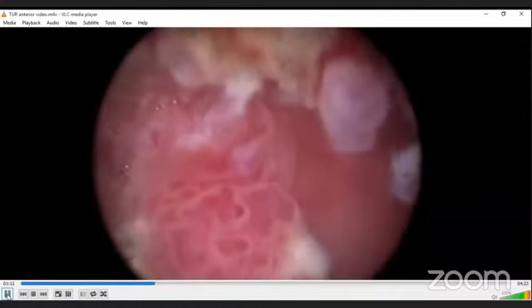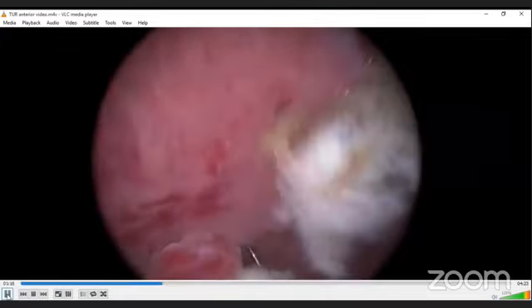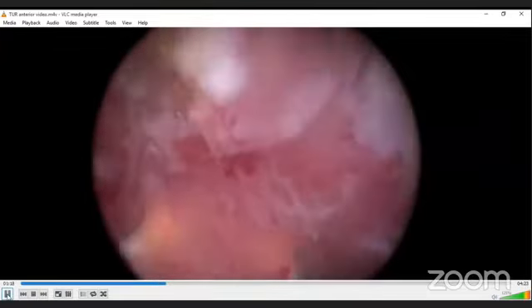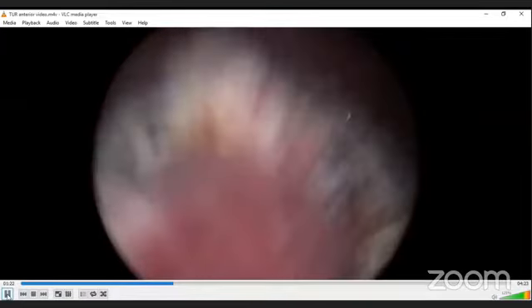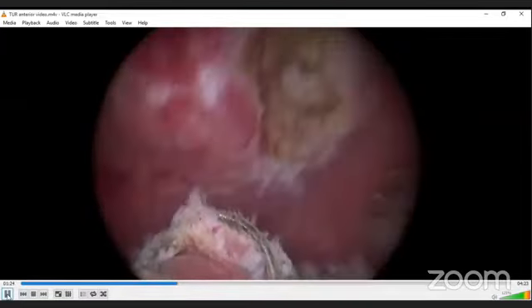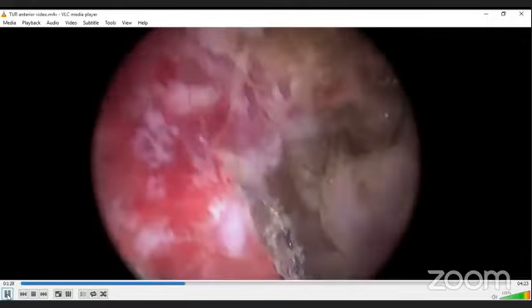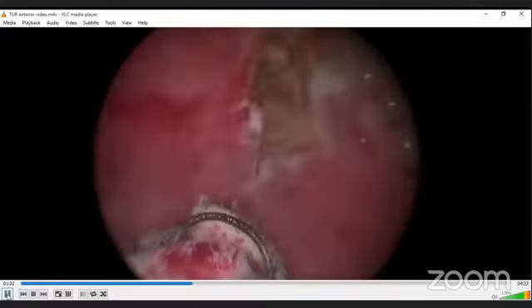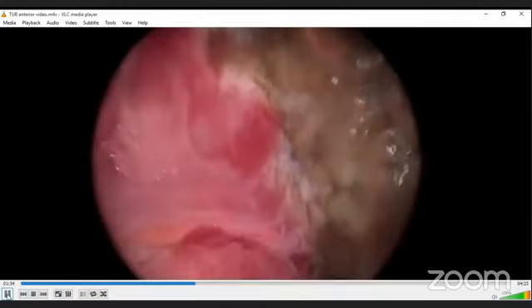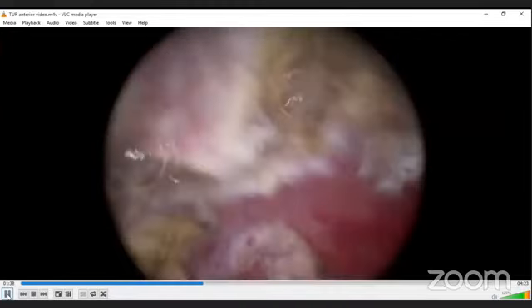So as we start the procedure, we keep the bladder semi-full, and then as required, because of the reach which needs to be at the far end from the urethral side. So as we cut, we have to reach the bladder wall level, which is the normal level with our cuts, and cut should be adjusted in proper directions and probably in proper thickness.